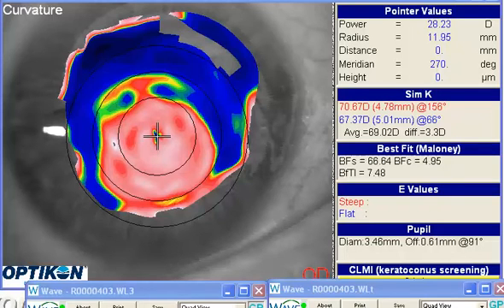I see from your case you have an advanced keratoconus patient that you're struggling with a little bit, going from a smaller diameter rigid lens, gas perm lens, to a semi-scleral lens that you've been working on. And I see you've had some trouble with trapping bubbles and some bearing and some edge lift.